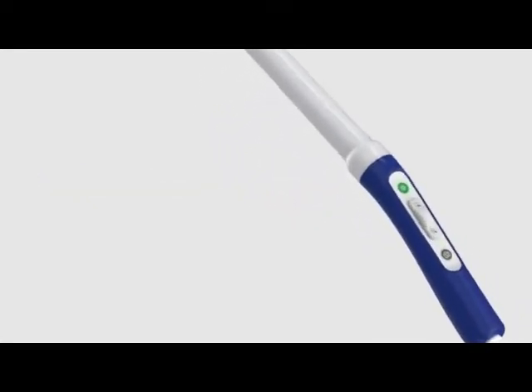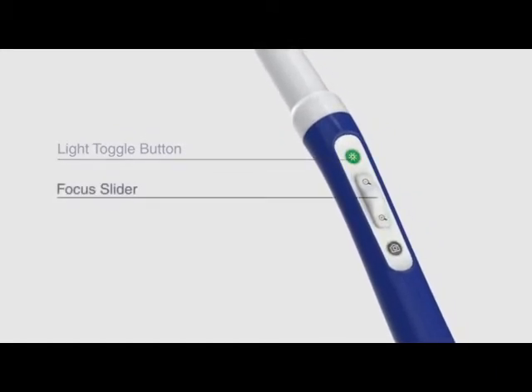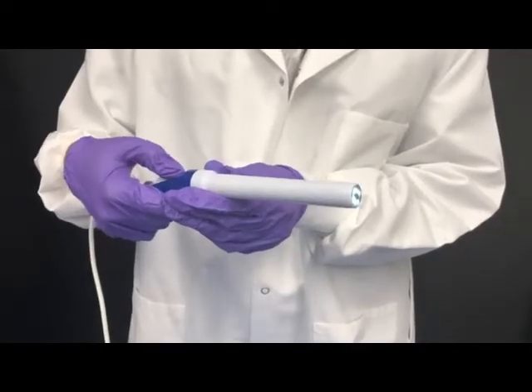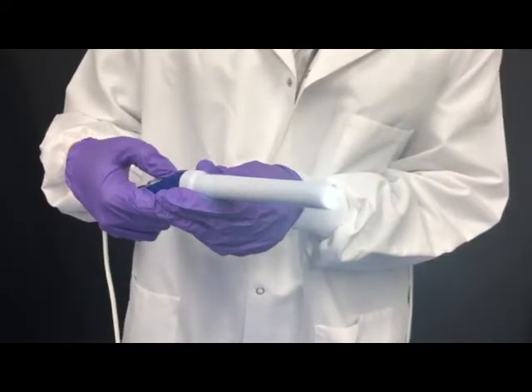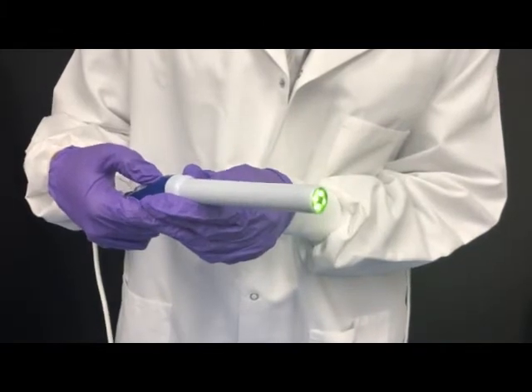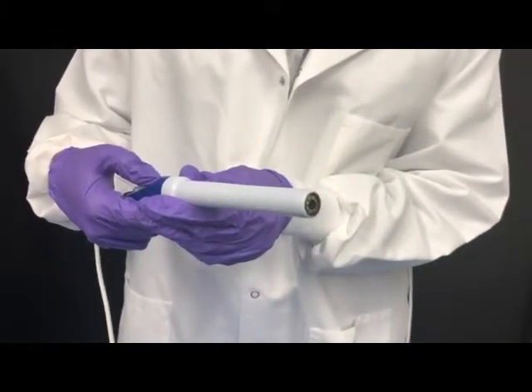The main controls consist of a light toggle button which adjusts the light settings by the camera, a magnification slider which adjusts the zoom, and a shutter button which can be used to capture an image if you have the latest version of the pocket colposcope software. Pressing the light toggle button once turns on the normal light. Pressing again makes the light brighter. Pressing a third time turns on the green LED light. And finally, pressing a fourth time turns the light back off.